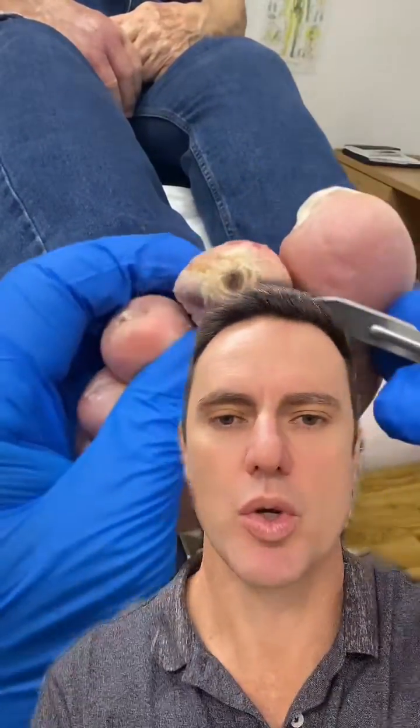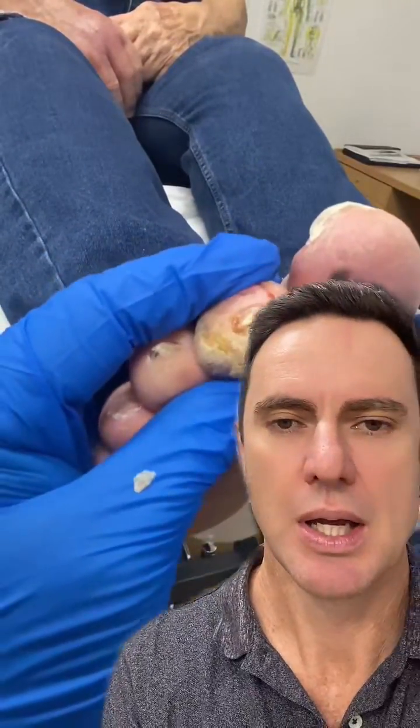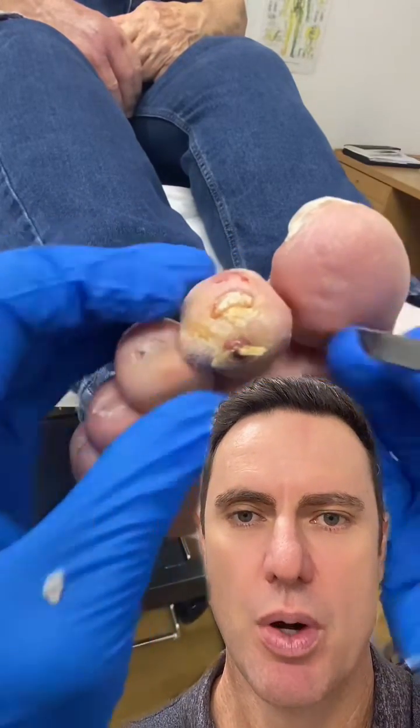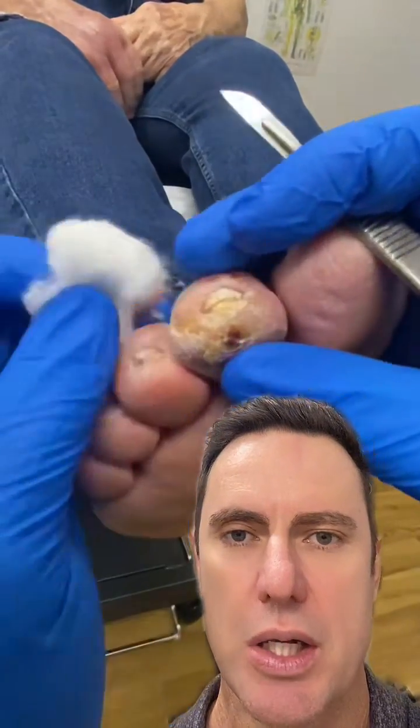Hey guys, this is Kent here, the podiatrist from Ergonix. We've had a few comments on one of the videos that you can see just here above me. What we're doing here is debriding an infected ulcerated corn.